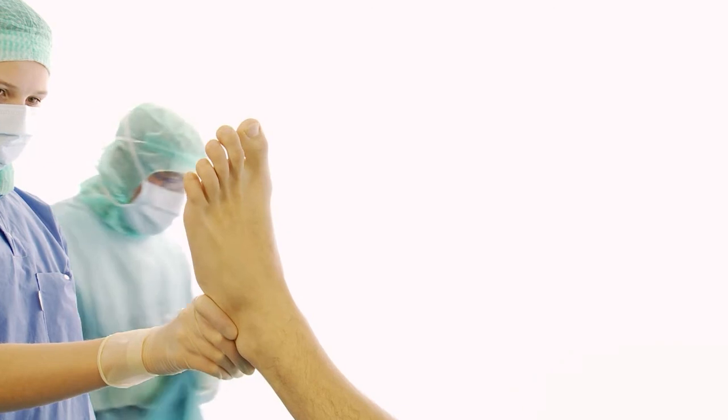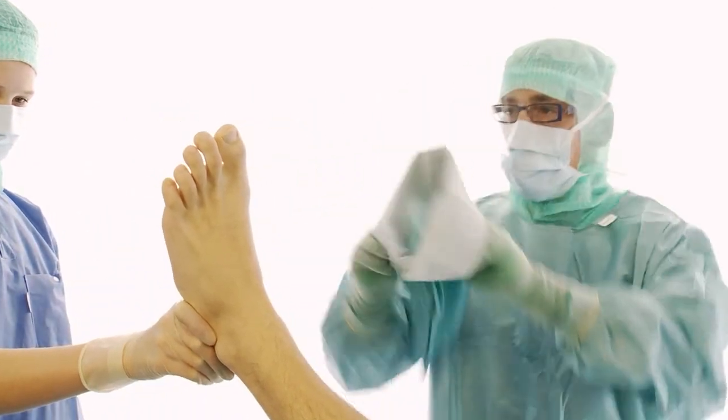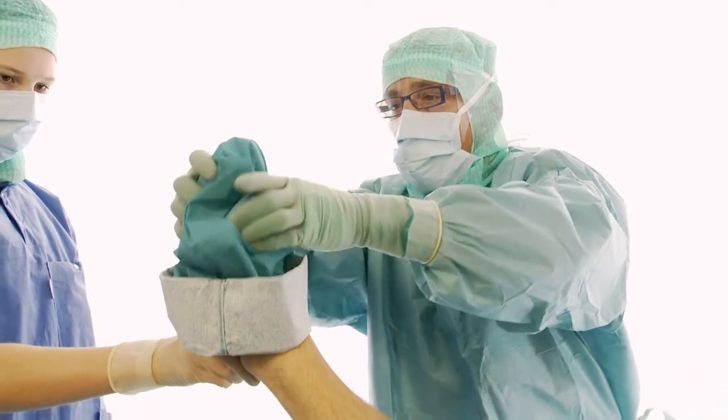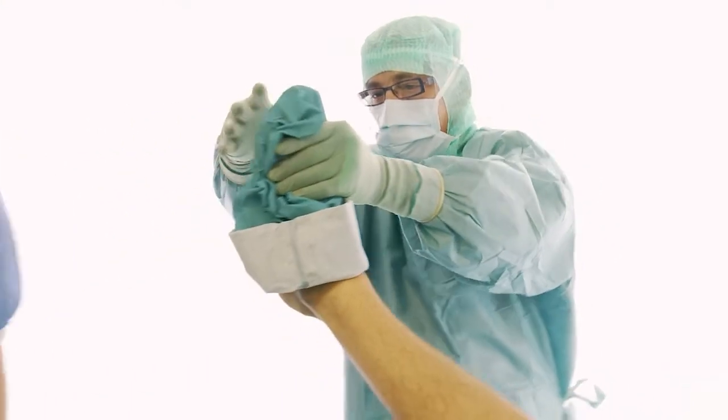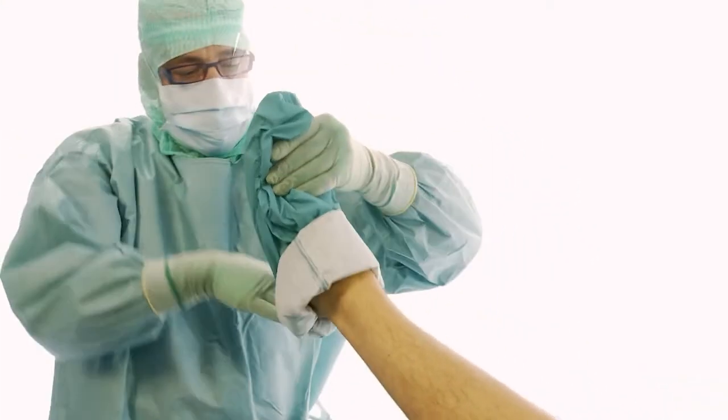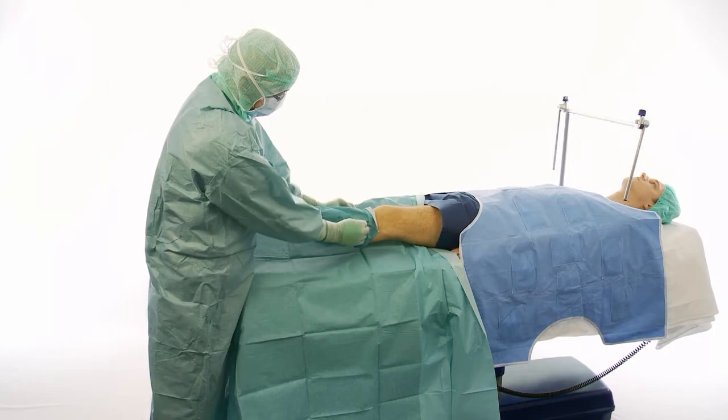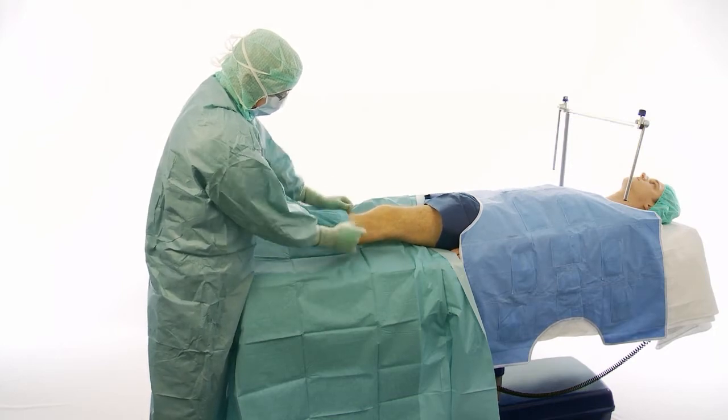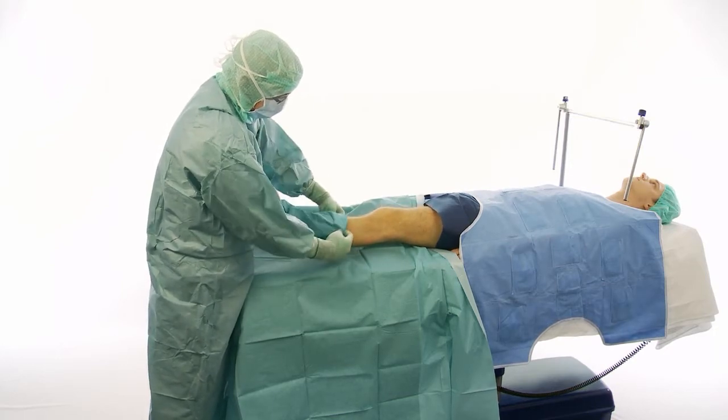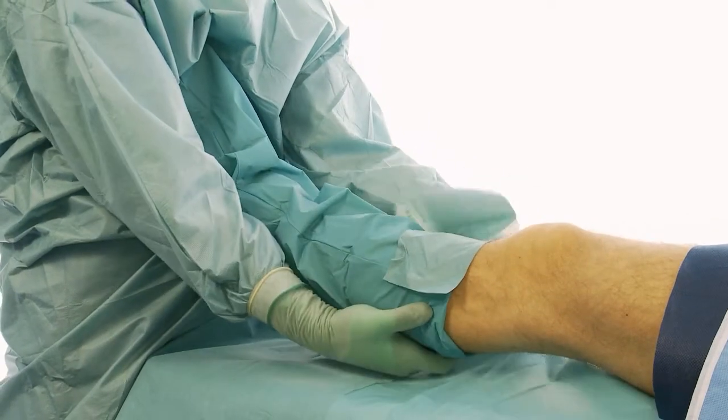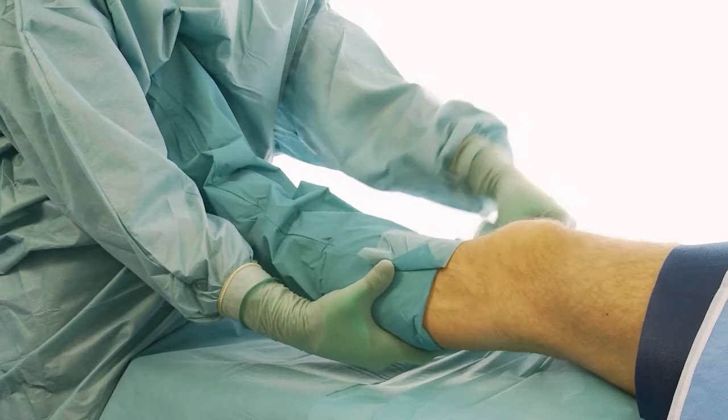Cover the leg with the stockinet. Fix it with the OP tape.